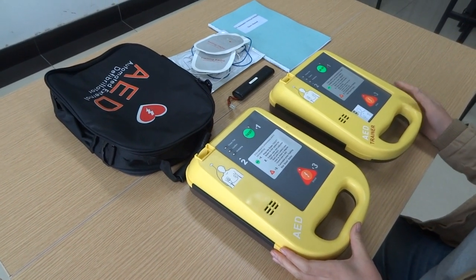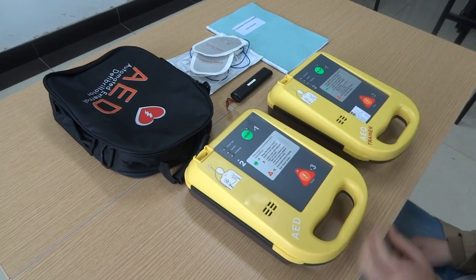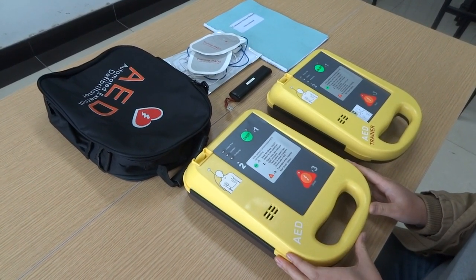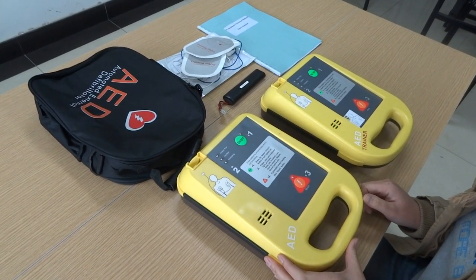Dear customers, thanks for using our automatic external defibrillator. Let me introduce the specific operating methods. First, it's about our accessories and main part introduction.